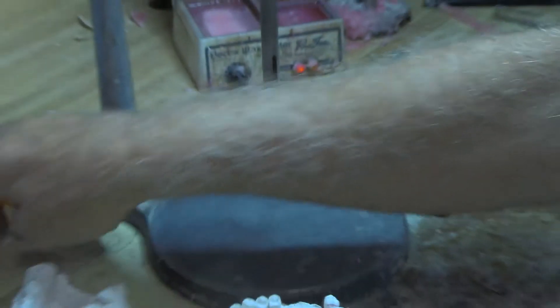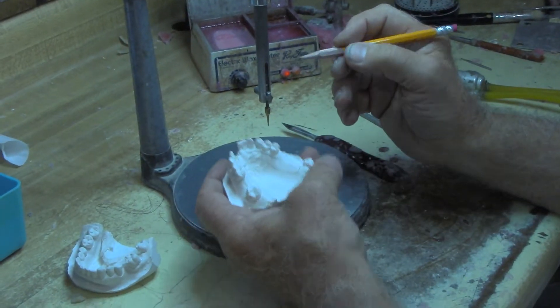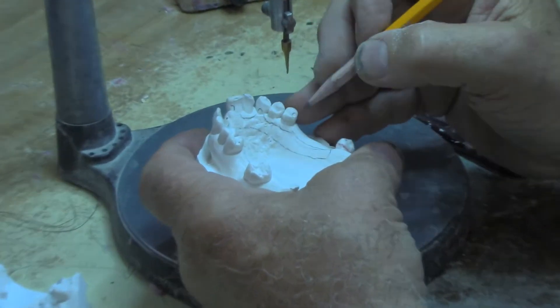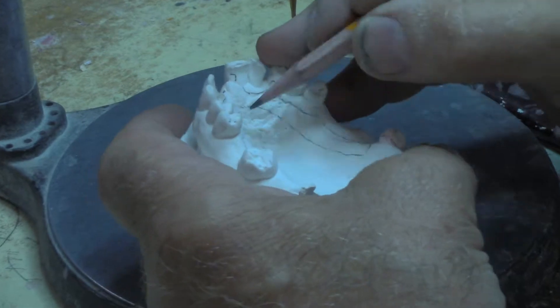After I do that, I draw on there what I want as far as the design. This comes from the doctor — he wants rest here, rest here, rest here, clasp, clasp, clasp, and he wants a narrow horseshoe. He doesn't want a wide horseshoe, so I'm going to give him a narrow horseshoe.